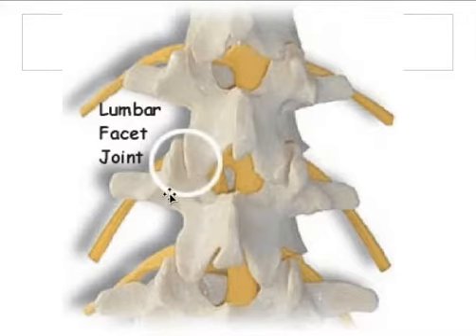So, first thing is grab your patient, find and mark the spinous process. You can actually draw a little circle around it. You'll draw a circle there, find the center spot, and then just go lateral to that. You'll be right in that facet joint. Easiest way to find it.